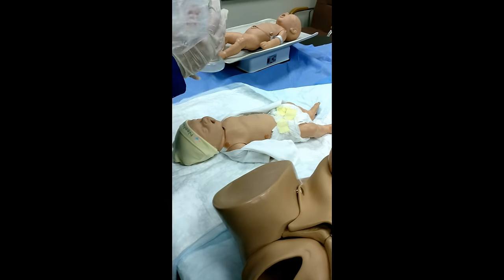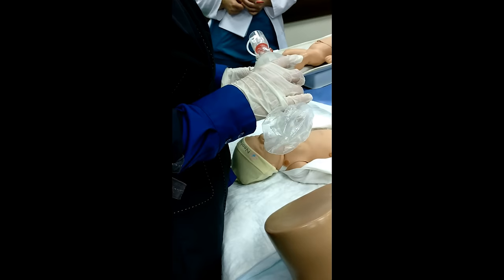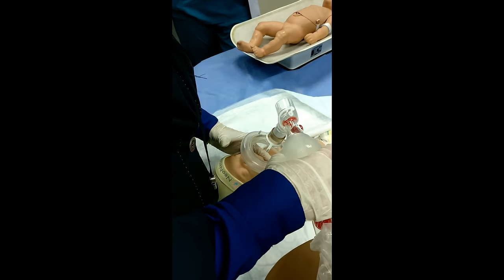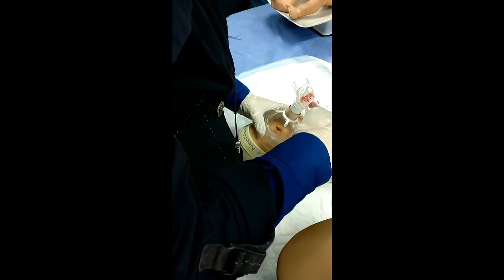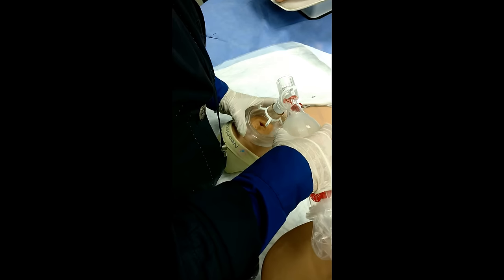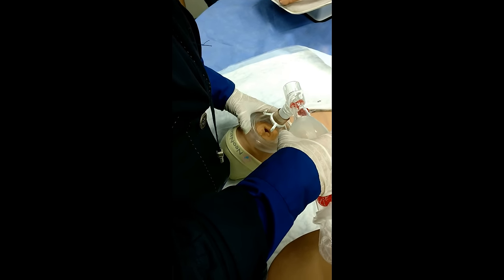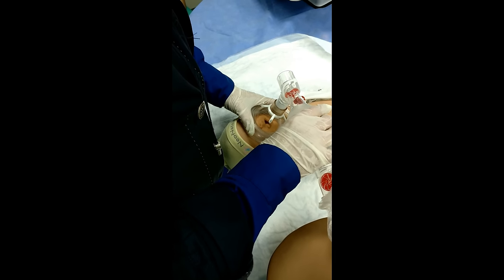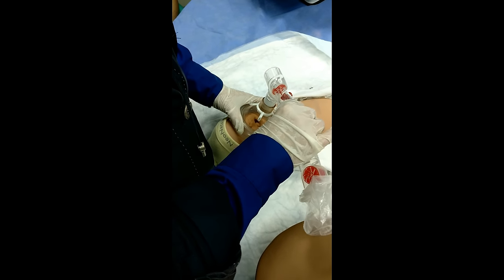We use the mask. We'll look at the good position of the mask. It's too big for the newborn, but we'll change it. So, position: the mask should cover the mouth and the nose, but not the eyes. Two fingers maintain the mask on the mandible, the second on the nose. The rhythm is inspire, expire, expire.